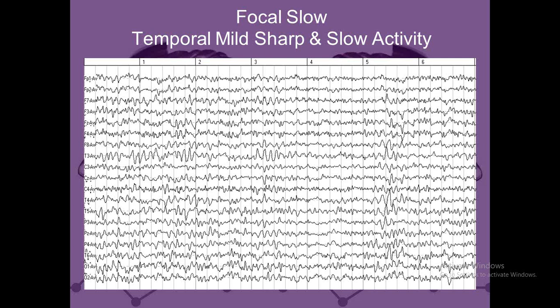Okay, this is temporal mild, slow, and sharp activity. It's very easy to see, and it looks pretty common throughout this whole thing. It's not that impressive, but when the doctor calls it, you need to check, because either there's a problem with the blood flow in the brain or getting to the brain, which means it could be cardiovascular in the pump, or it could be cerebral vascular in the brain, or something along that path between the heart and the brain. So somewhere in there, there's an issue that's causing this, and he will call it, and he'll talk about commonly seen cerebral vascular insufficiencies.